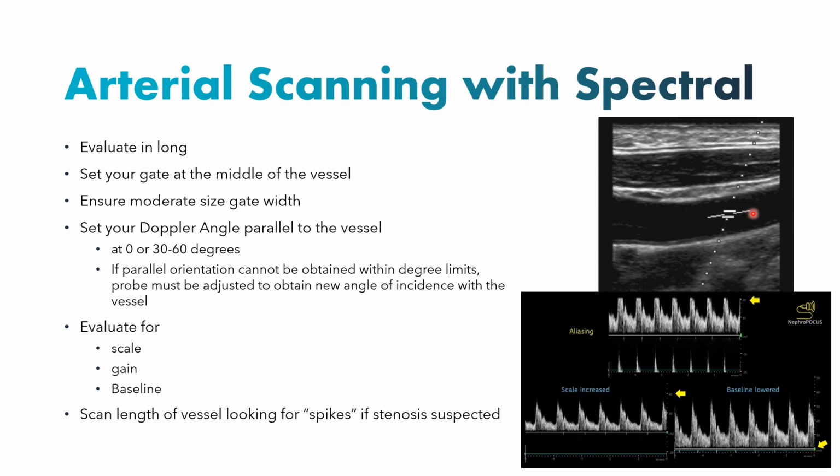So at your 30, so again, vessel is here. I'm making my gate centered, open just enough to get a good sample. I've got a parallel gate. And I'm going to double check and make sure that my Doppler line is between 30 and 60. That is going to optimize my accuracy.